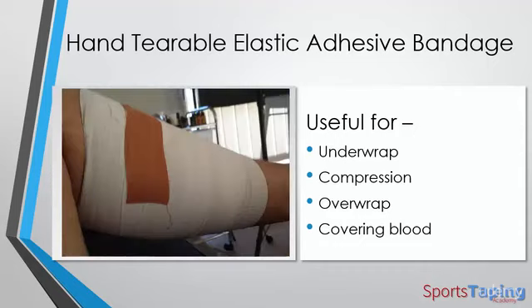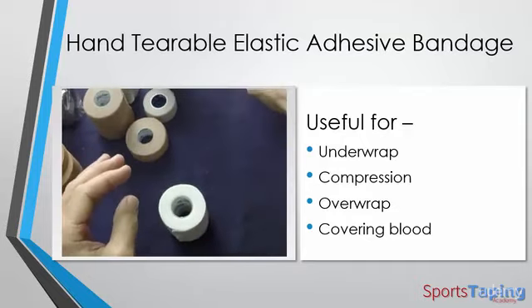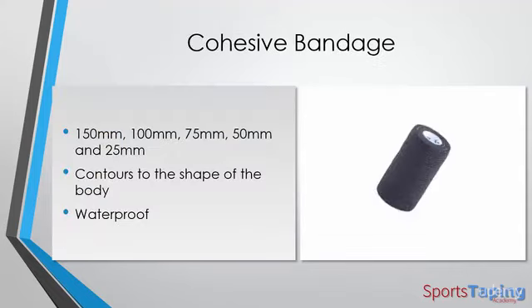In fact, here's a picture of my own calf from earlier this week, where I went for a run and had a little bit of an accident and had a slight tear. So after sticking some dry needles in, I compressed it with this type of tape, and as you can see, I've locked it off with the rigid tape. Once again, this tape comes in various sizes from 75, 50, and 25.